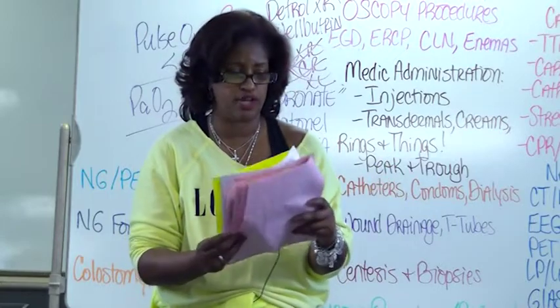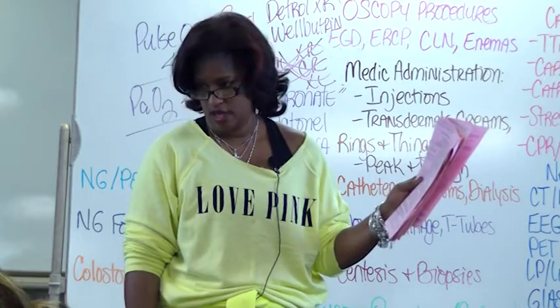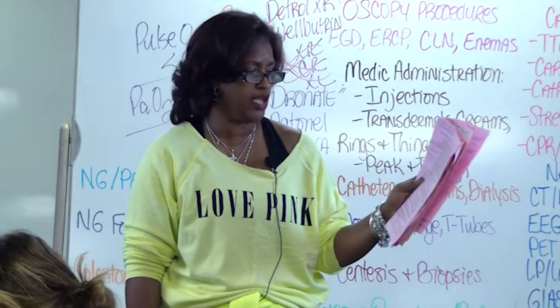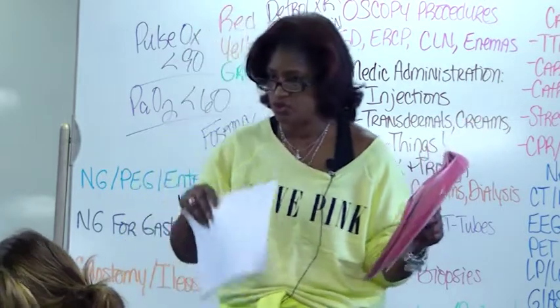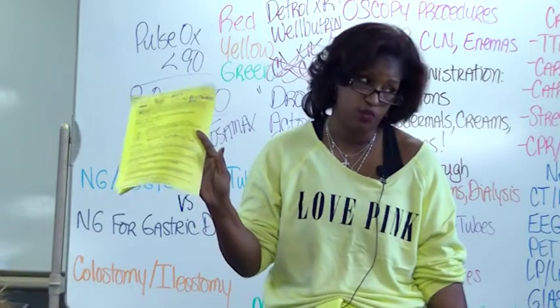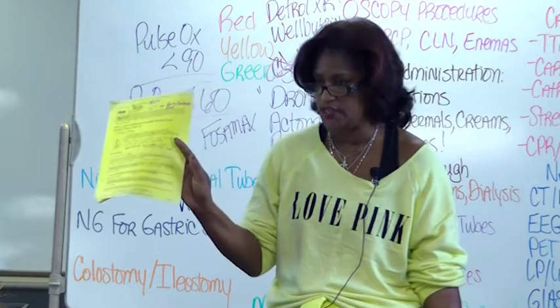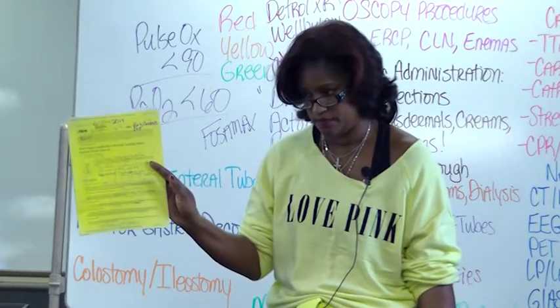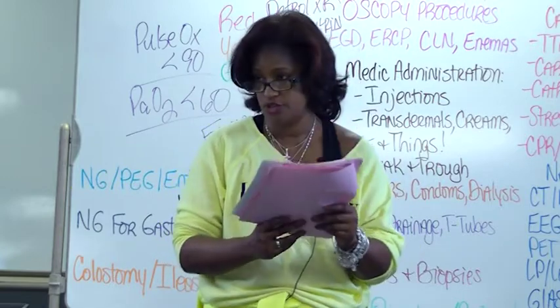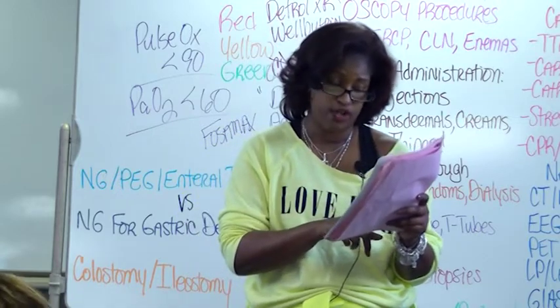I already wrote it on your pink sheet. You know I got you. I wrote it as big as life. On the pink, I wrote aspirate gastric contents, check the pH. It's only after you do that that you check the residual. That's why the word next is written there. It's not first, it says next. Okay? So be very, very, very astute on this one. Okay? Now, then it says you can give your meds.